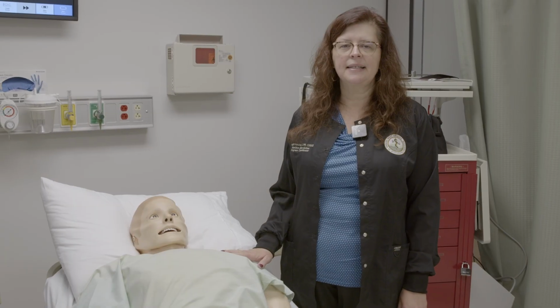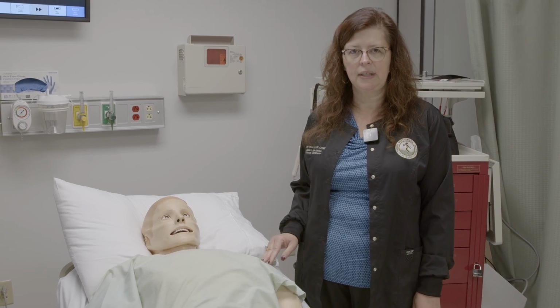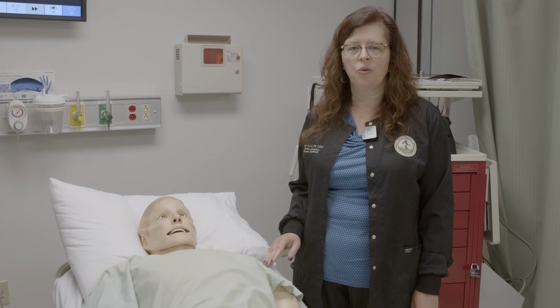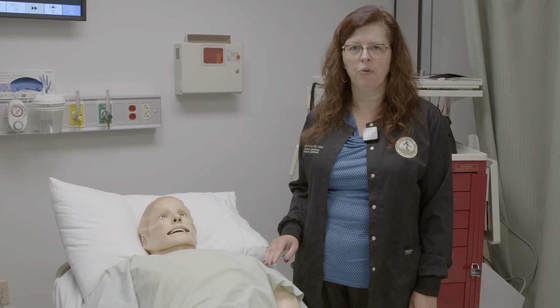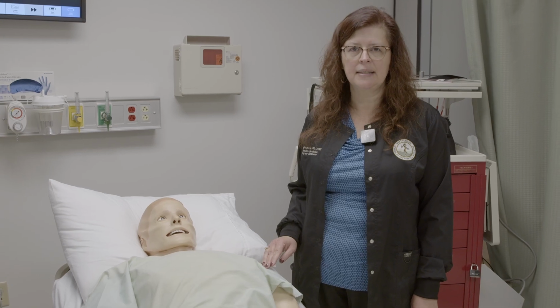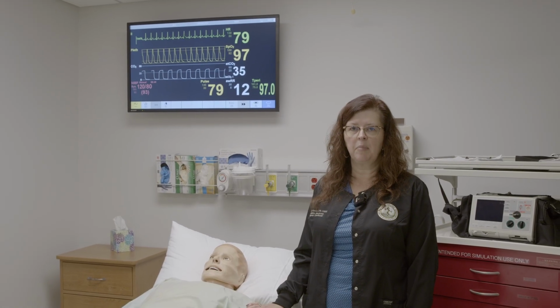The simulator has the ability to seize. IM injections can be placed in the left deltoid. He has blood pressures in the left arm. He has carotid, femoral, brachial, radial, popliteal, dorsalis pedis, and posterior tibialis pulses. We ask that you do not place paper or ink near the simulator, as these items can transpose onto the skin. Your scenario today may include a patient monitor.